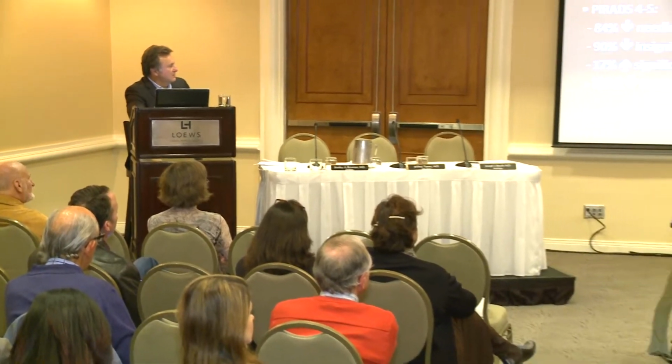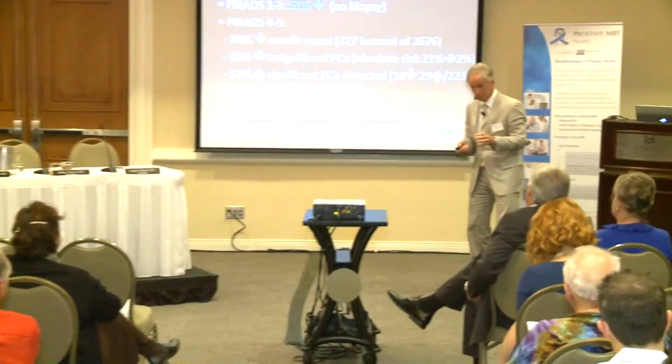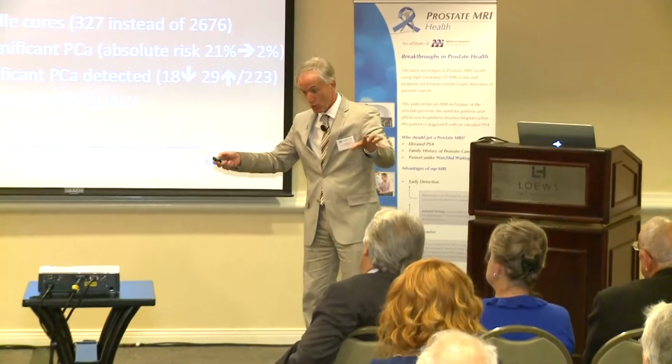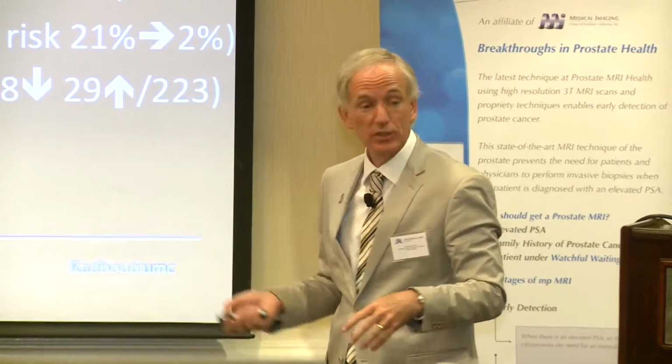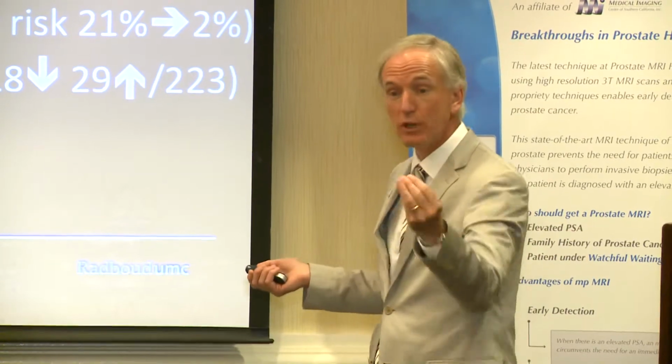And a lot of urologists say to me, okay, this is nice, Jelle, but can you validate it? Do you have data? Okay, we did a study in Brisbane, Australia. There was a very enthusiastic urologist who came to our place, and we taught him and his team the technique. And then we did an evaluation. He said, Jelle, I want to run a study. So we discussed the study, and he actually had a patient population with elevated PSA, naive, so that means no biopsies before, only elevated PSA, and all the patients underwent the routine TRUS biopsy, 12 needles.